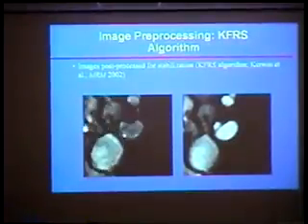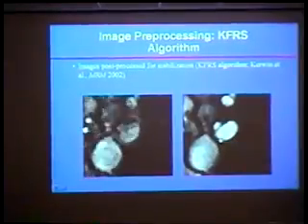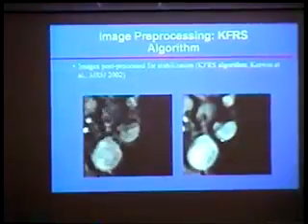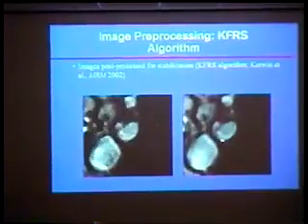So Bill Kerwin, who is currently a faculty member in the lab now, developed a technique that can filter this type of motion out of the data so that a pixel-based analysis can be used.